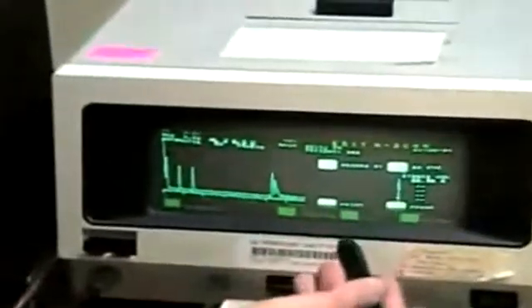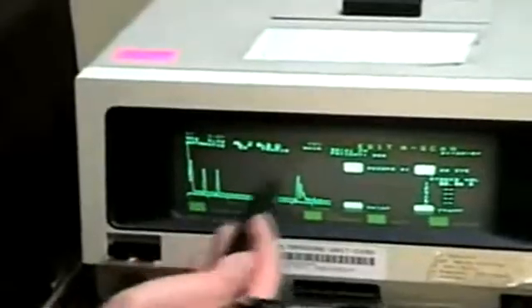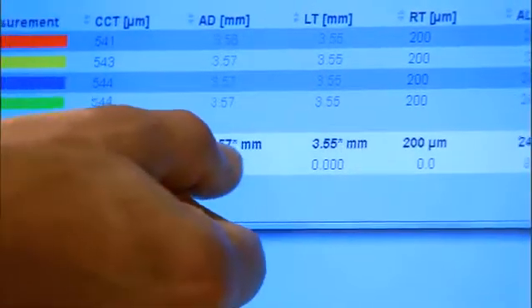Prior to LensStar, surgeons using optical biometry had no ability to calculate lens thickness and could not accurately use a fourth-generation formula. The LensStar calculates lens thickness and thus solves the problem.